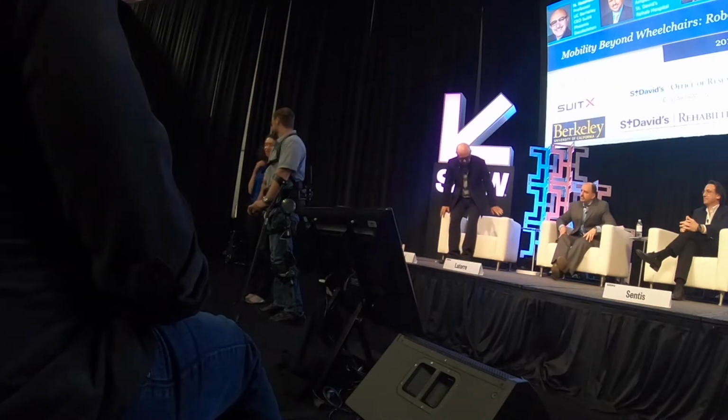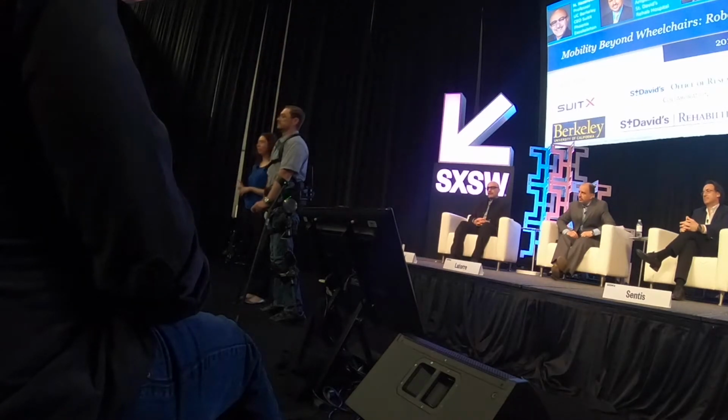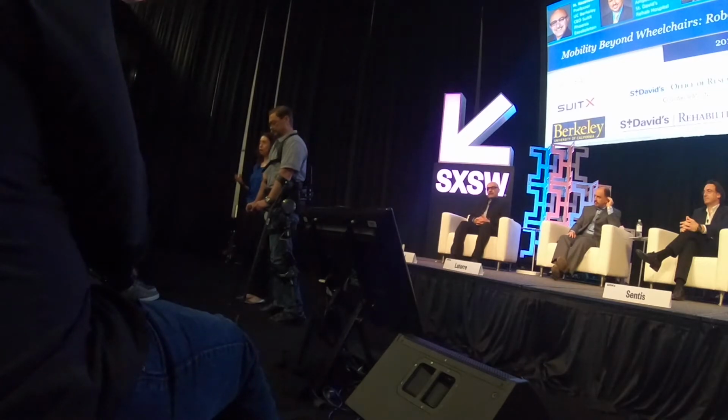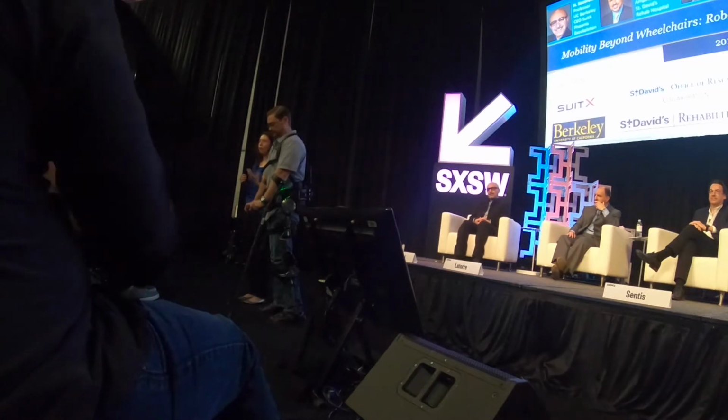For anyone that's curious, the process of learning to use an exoskeleton is similar to the process of anyone going through rehabilitation, learning to stand up and walk again. So, for example, anyone who has had an injury has to relearn how to do activities to prepare for walking again. When someone comes in, we make sure that they're safe to use an exoskeleton and safe to start walking. And we practice standing up, balancing, weight shifting, all the things that you would need to do to be able to learn to walk again.